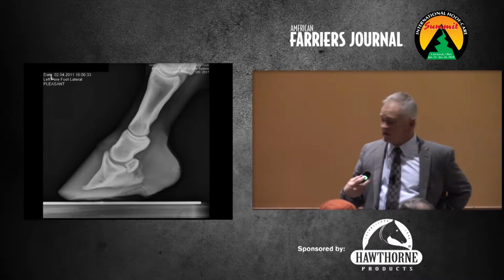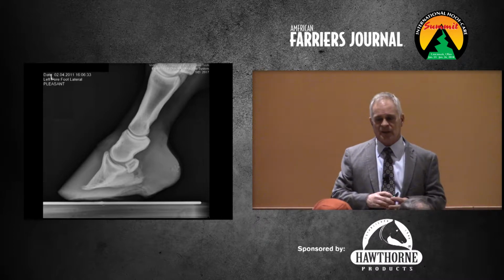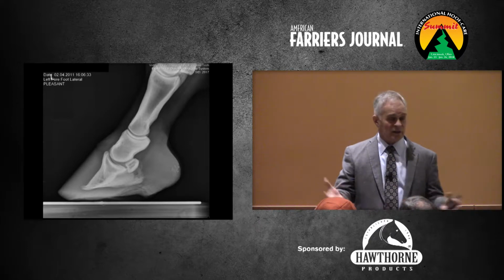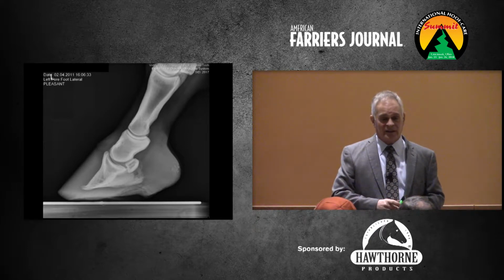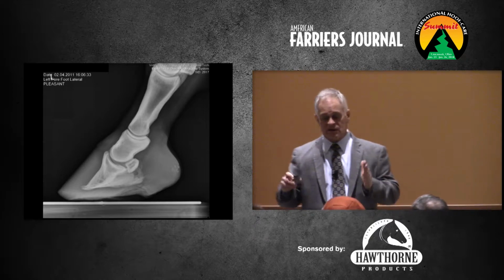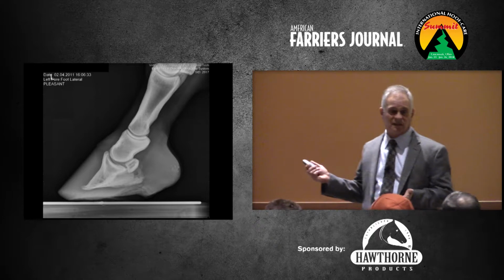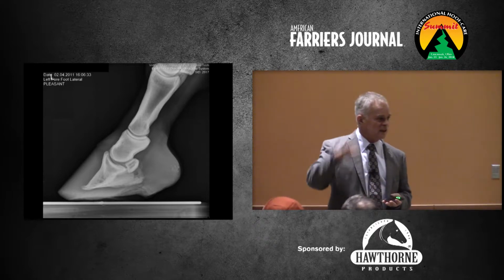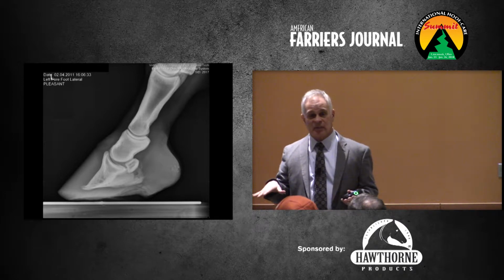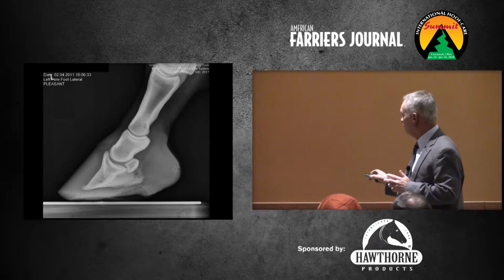Okay, so again, what we chose with this one is just to do a light trim, touch the heels down, dress back the front, but this mare was sore enough at this time, we weren't going to push it, and so she was put in the closed cell foam pads and soft rides until she got comfortable. Then we started using radiographs to guide the trimming and shoeing to where, within 6 months she's like this, and then she's very happy because she's loading P3 in a much more appropriate way. She still has a chronic laminitic foot, but she's much happier this way than she was that way.